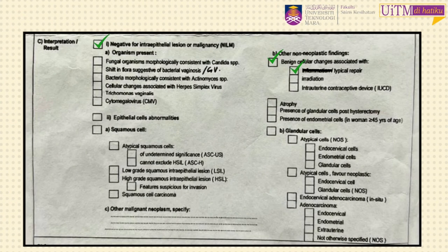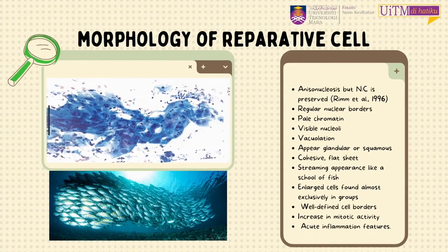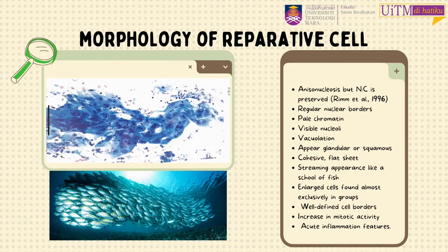This is how we report reparative cells in cervical cell reporting. The prominent features of reparative changes are anisonucleosis, where some nucleus sizes are normal and some are enlarged but not more than two times. The nucleoli are visible and chromatin is pale. In the reparative state, squamous cells appear as cohesive, maintaining polarity between neighboring cells, giving a streaming appearance like a school of fish or a pool-like structure.